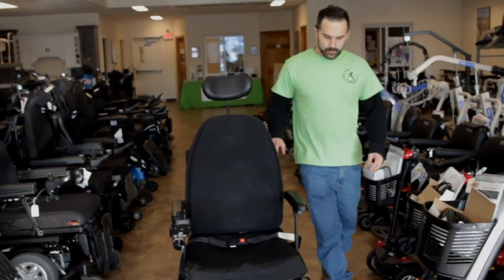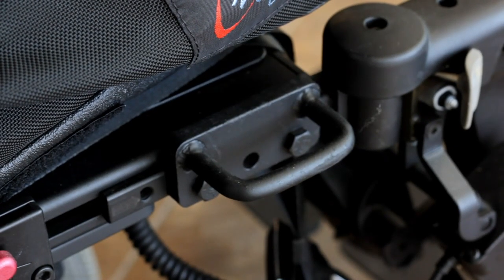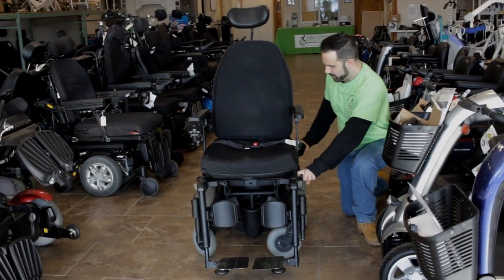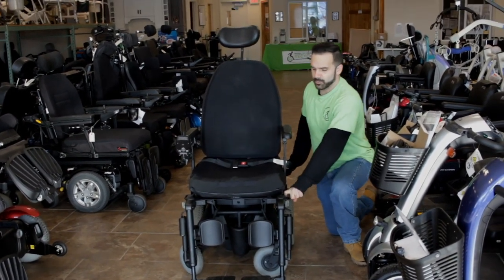Next up to highlight would be these transit loops, which are located on all four corners of the seating assembly. These will be utilized so that they can safely transport you.